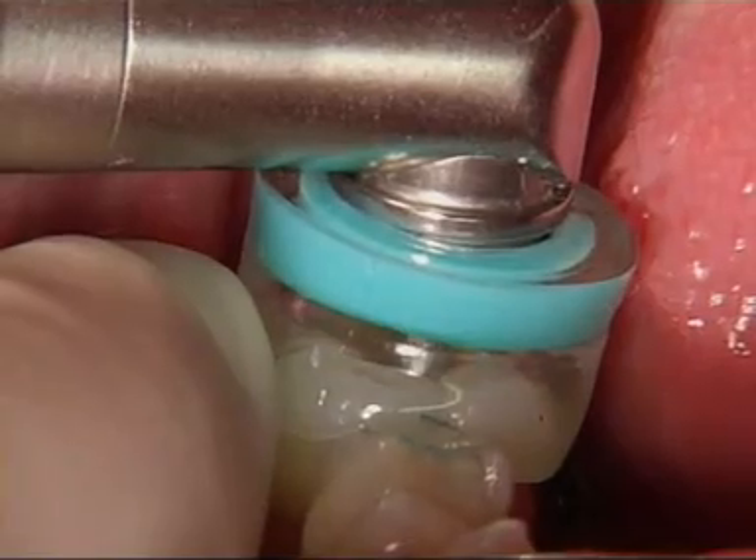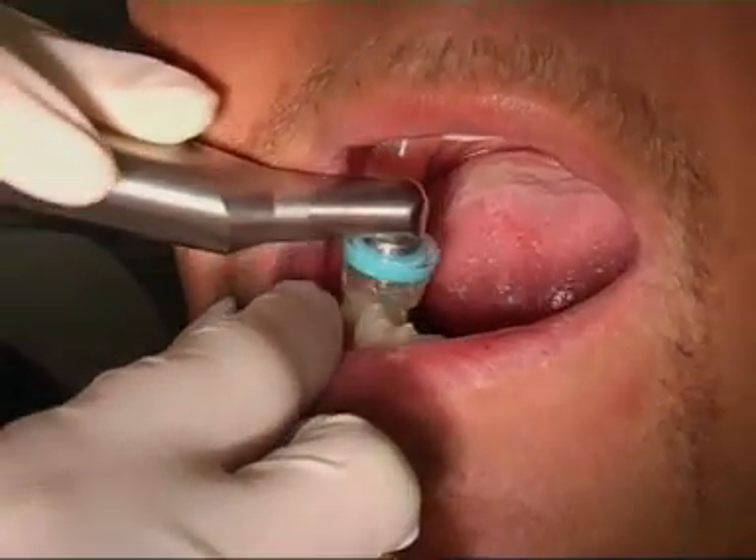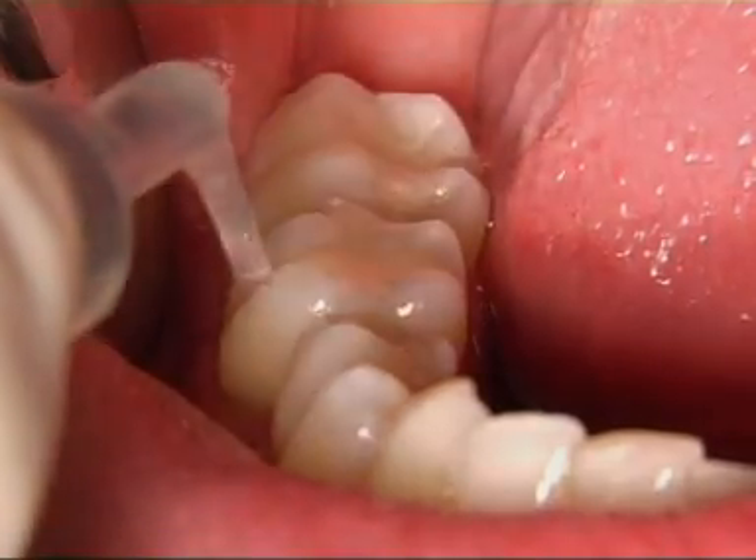Welcome to the future. You are about to be introduced to a completely new kind of caries treatment and prevention. Kevo HeloZone for minimally invasive, gentle and pain-free treatment. The ideal solution for both your practice and your patients.